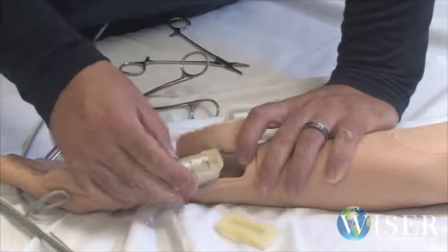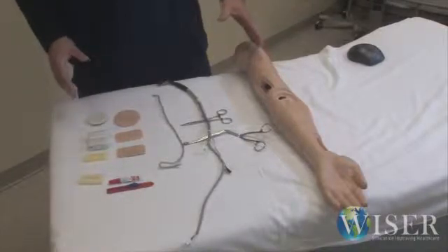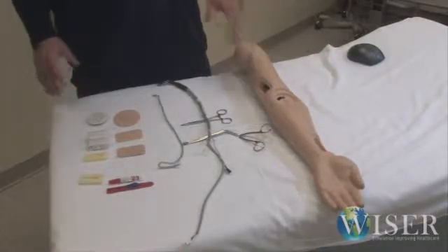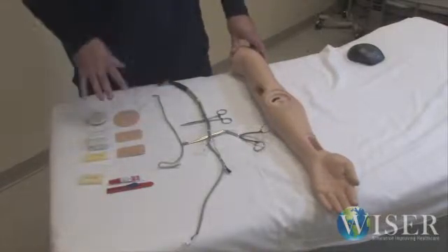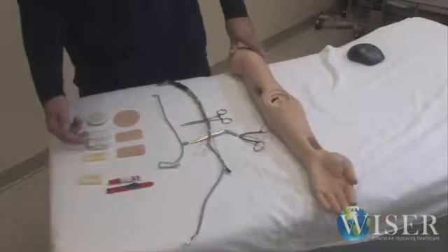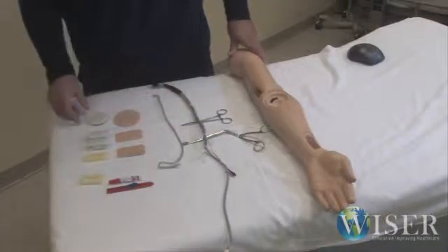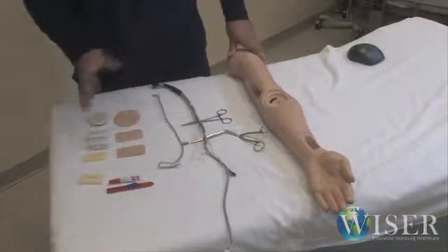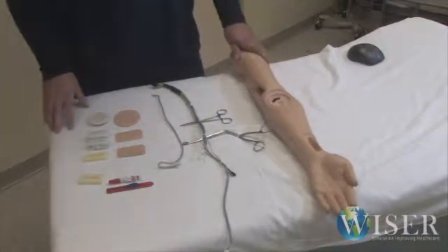Sometimes these go bad, and you can get these modules from Laerdal, and you can replace them yourself. Okay, so once you have determined that the issue with your pulses is physical and it's part of the hardware, this is the arm broken down in all its different pieces. So whether it's your modules have gone bad, or maybe your wire got destroyed somehow, or possibly the speaker went bad or got destroyed, or anything like that, this is every functioning component of the arm. So just to give you an idea of everything.